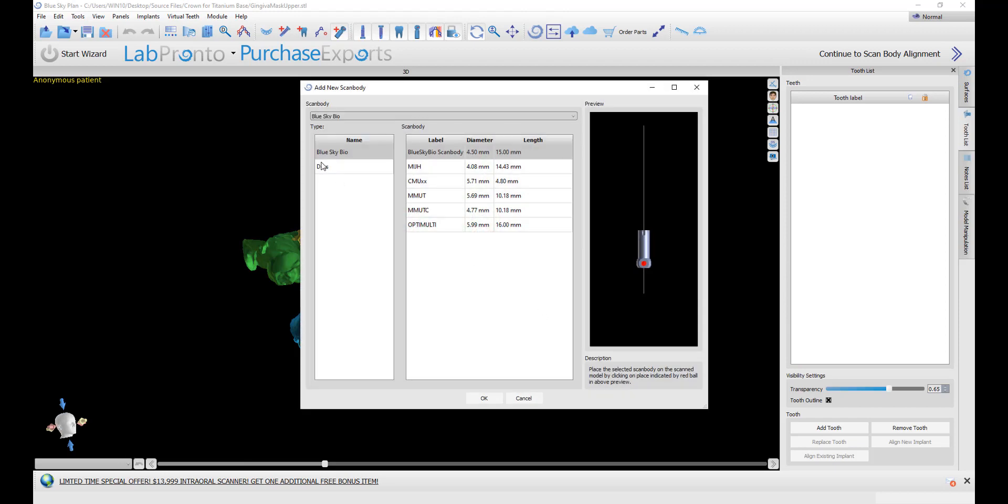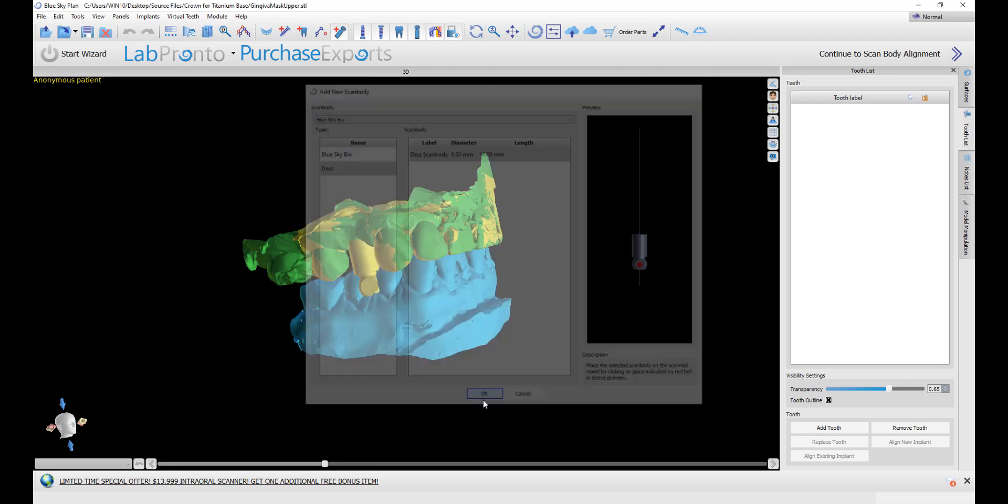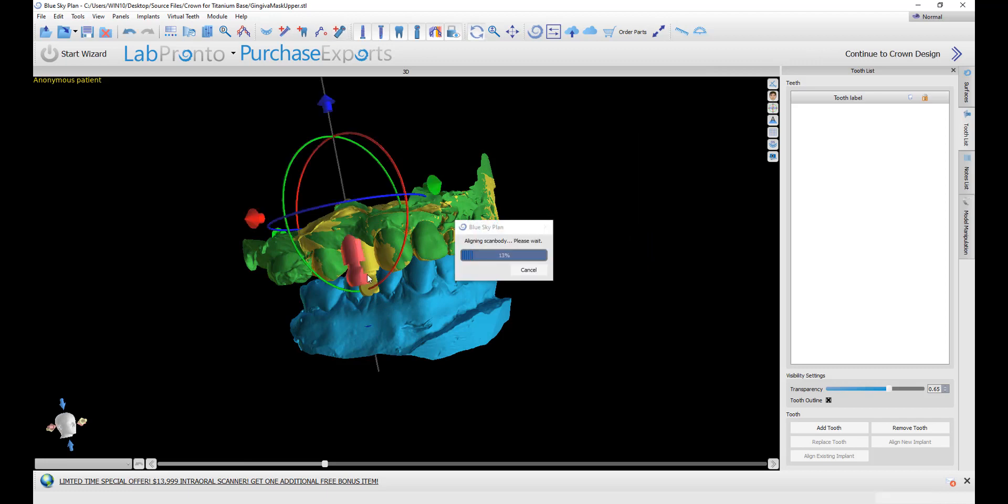We could select the relevant scan body and then press OK. We now want to click once in the center of the flat area of the scan body, again assuming there is one. The software is going to do the alignment automatically.